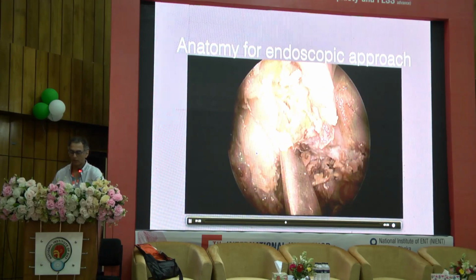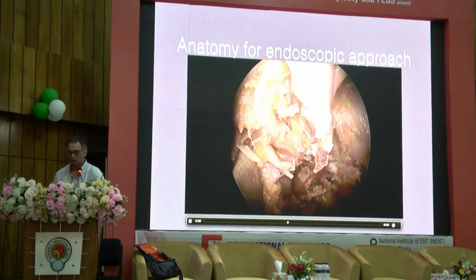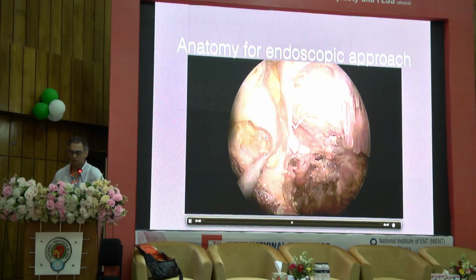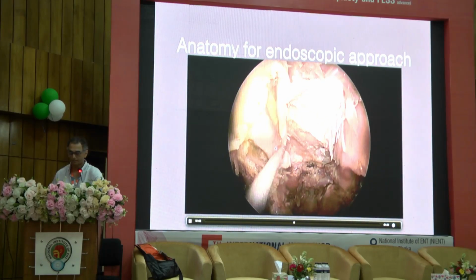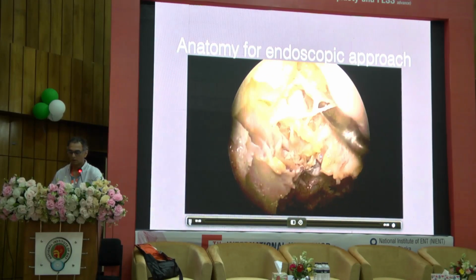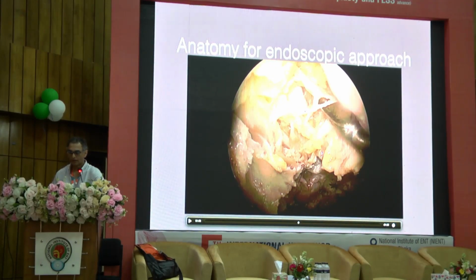And if you go further in through all of this, then only you will see the optic nerve, and in this case you are seeing the third cranial nerve. Okay, so you're seeing, let me just move that muscle back. So you're seeing the optic nerve here, and you're seeing the branches of the oculomotor here. So this is superior orbital fissure. This is optic nerve. Now you see the amount I've gone through to reach the optic nerve. So to damage optic nerve in the globe is very difficult, right? You have to go through mucosa, bone, periosteum, fat, muscle, and only then you get there.